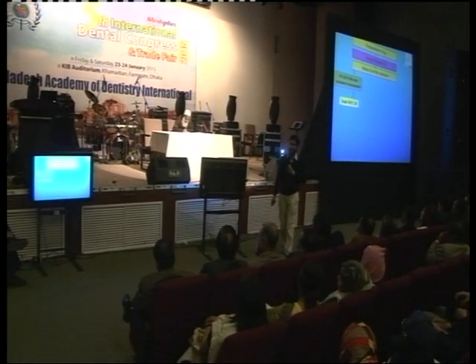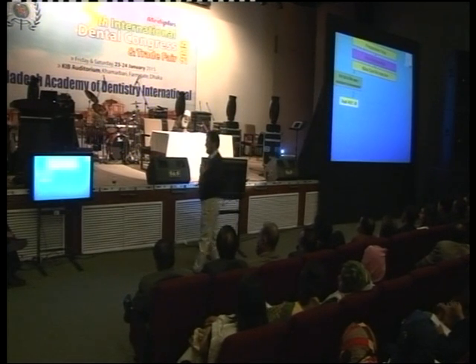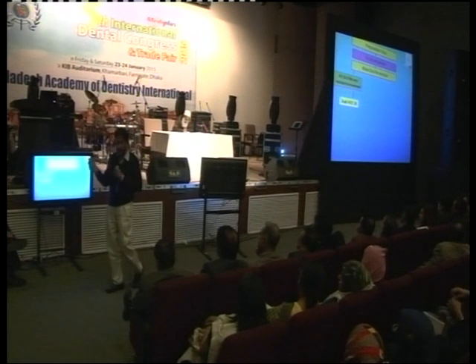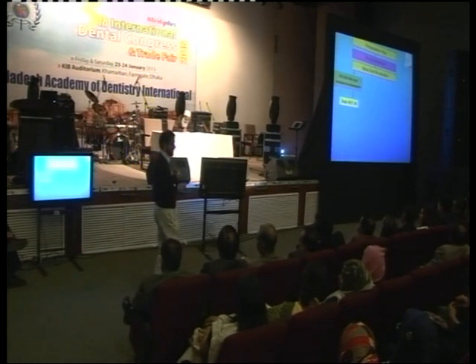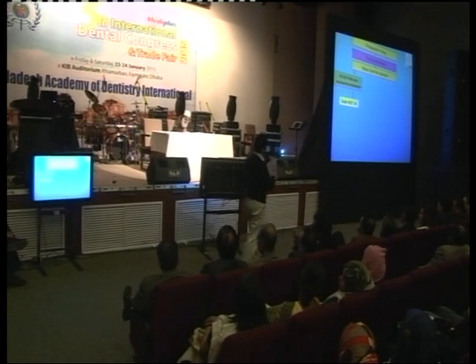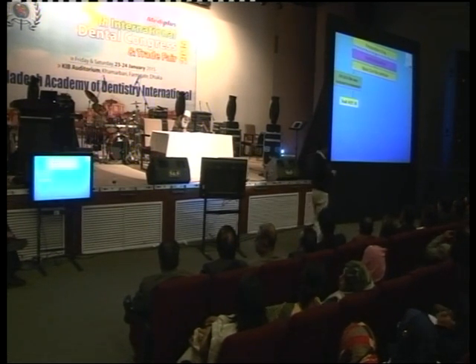If you introduce the number 10K file into the canal and feel resistance to the movement, then you will use the small file for this canal. And this small file is the number 21, tip diameter is 21 and the 6% taper.